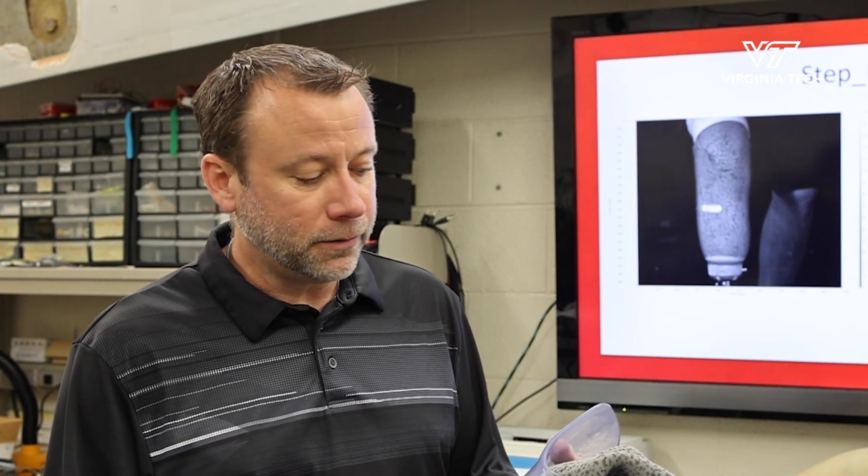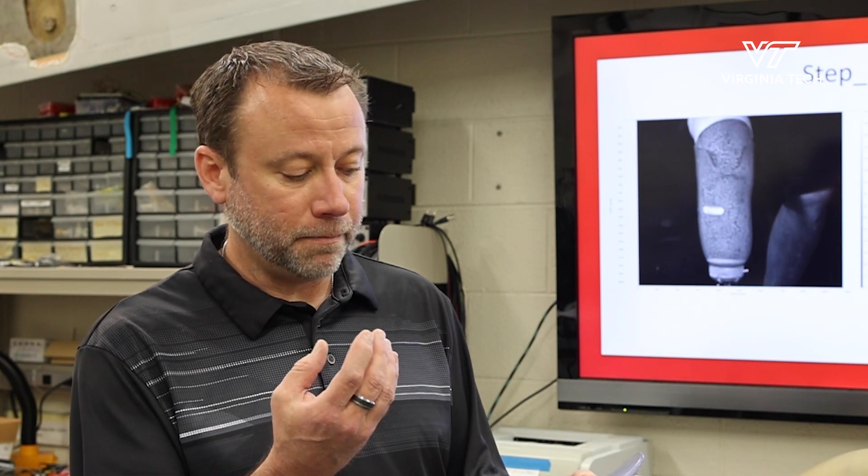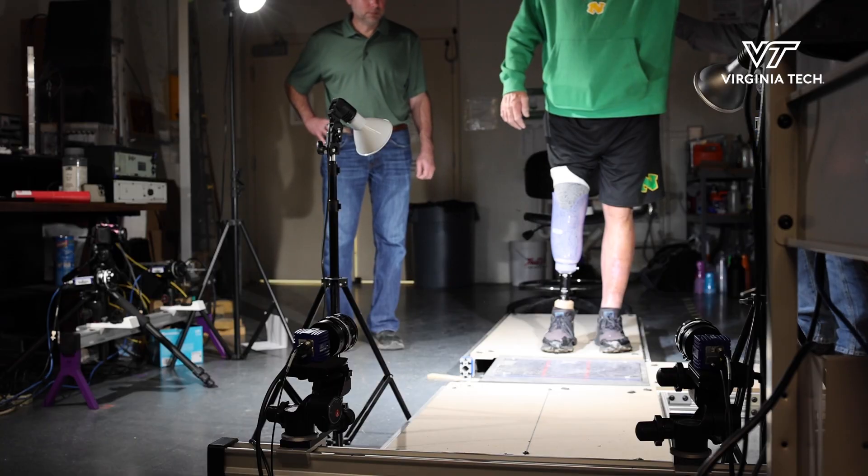What we're applying is a new technique called digital image correlation for measuring how the limb is going to deform through the prosthetic socket.